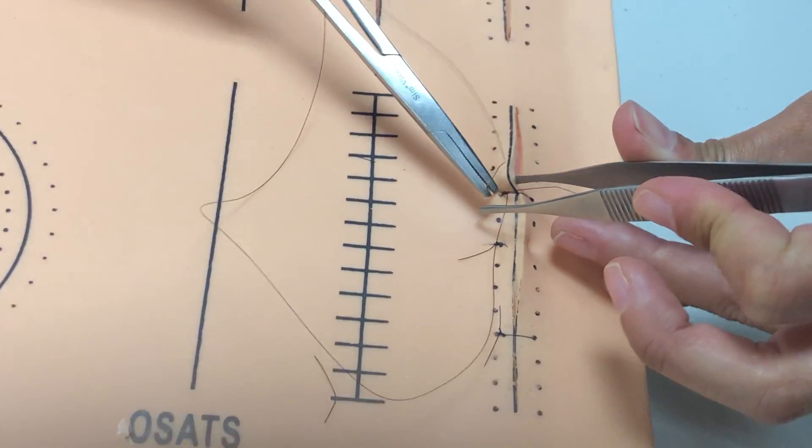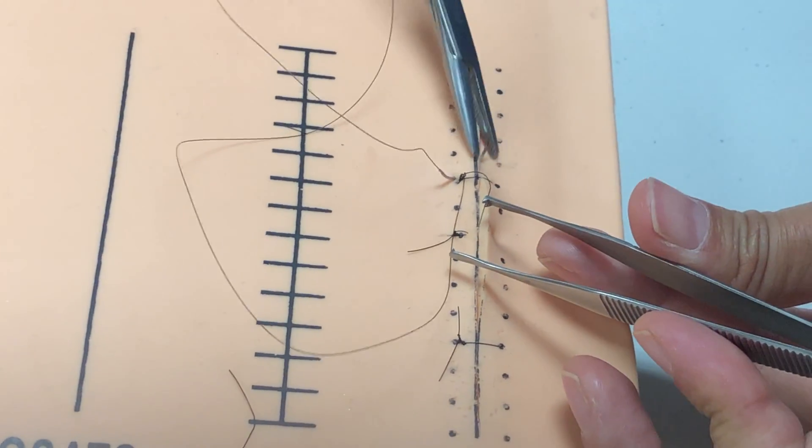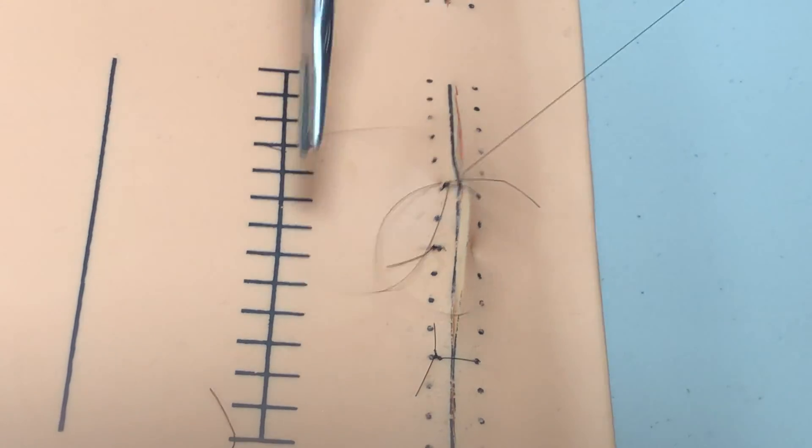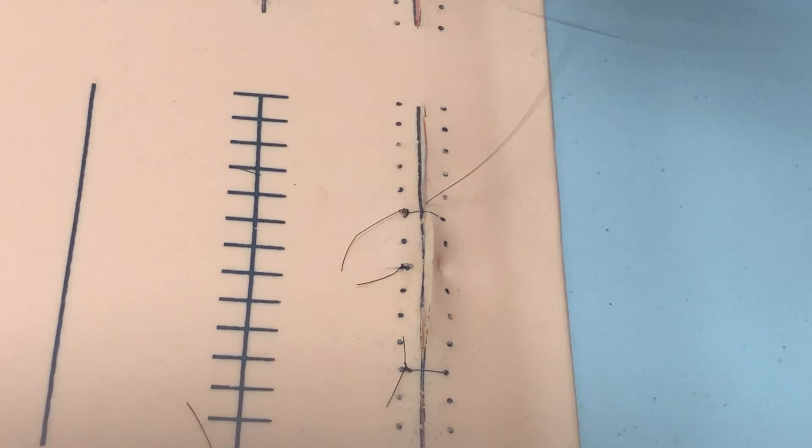Not cutting it, but just right next to it. And we're going to come through in the middle. So we're going to lay that nice and flat. It kind of disappears.